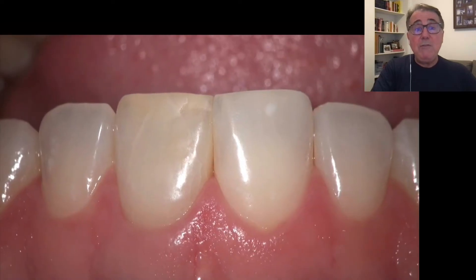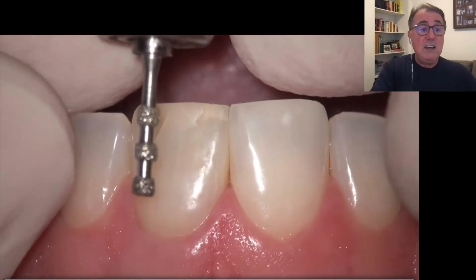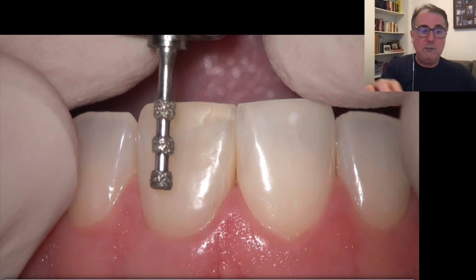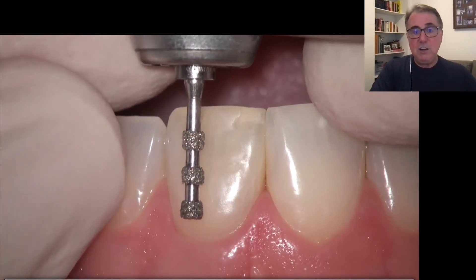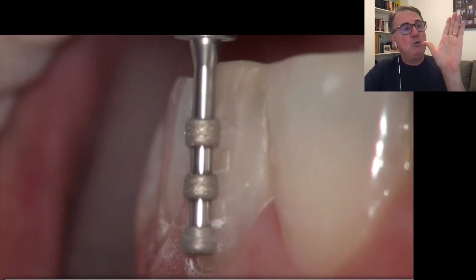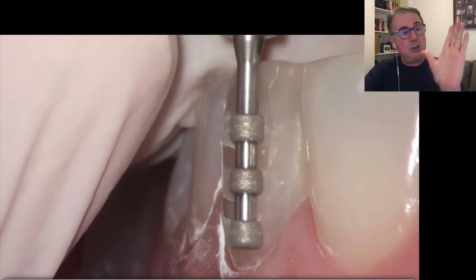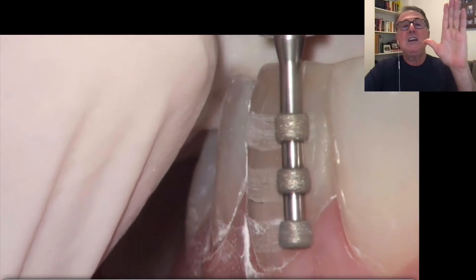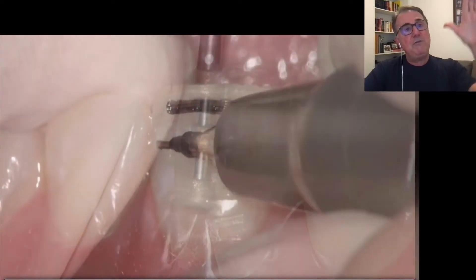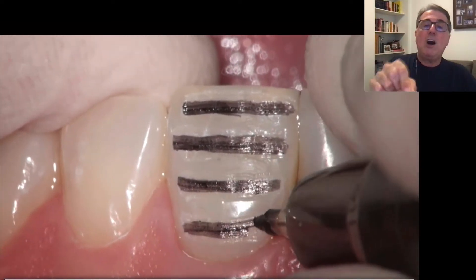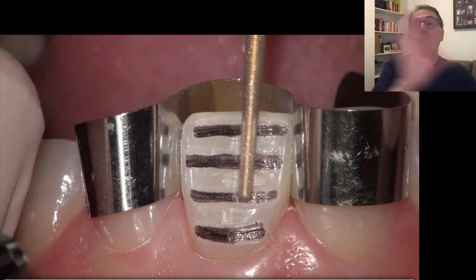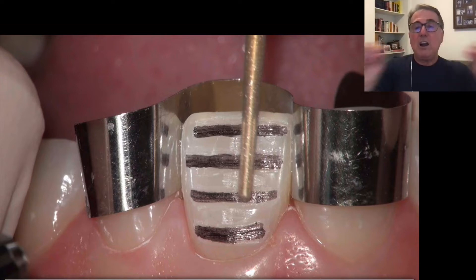Now we're going to start our preparation. This is a depth cutter of 0.3 millimeters deep. We're going to make grooves on the surface of that tooth in three different planes: one plane accordingly to the cervical area, another accordingly to the middle of the tooth, and then another one at the incisal area. Then we mark down the bottom of those grooves, and with a long diamond burr, we prepare the tooth until all those marks disappear.